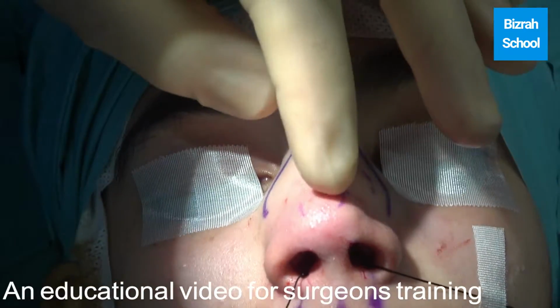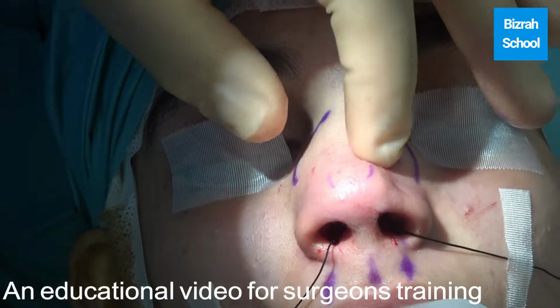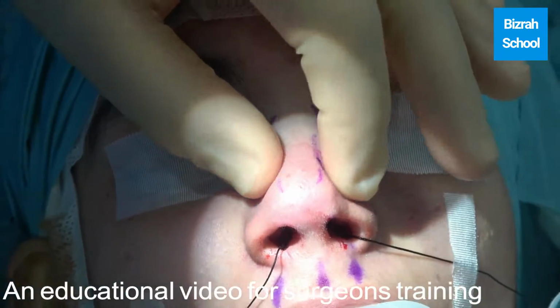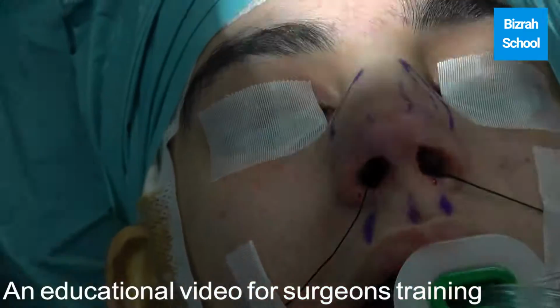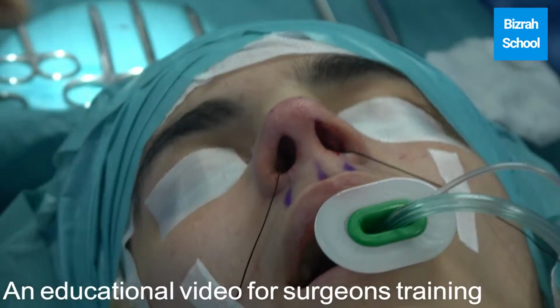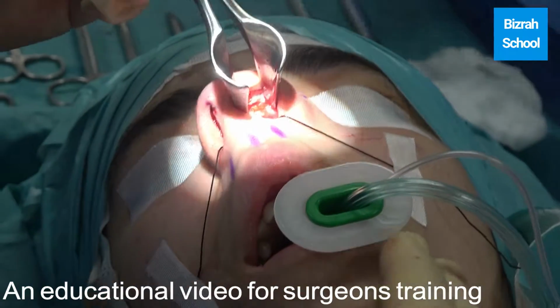Of course, the nose is still deviated, so we need to do the spreader graft here and the osteotomies, and then again we look at the tip and revise it. It needs more refinement. So now I would consider the spreader graft on the left side before doing the osteotomy, because I don't want the bleeding to make my life difficult.